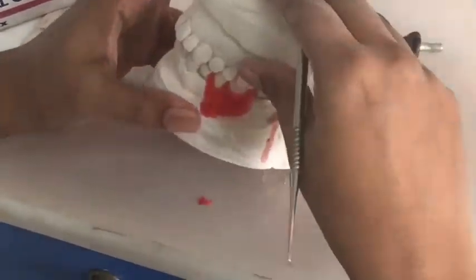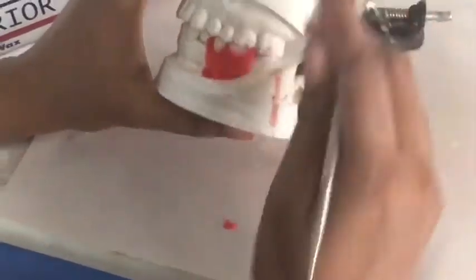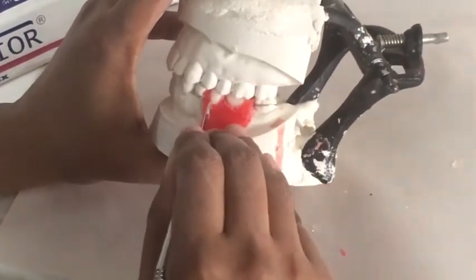Adjust your teeth in the wax and keep on checking the occlusion to make sure that there are no gaps in between the maxillary and the mandibular teeth.